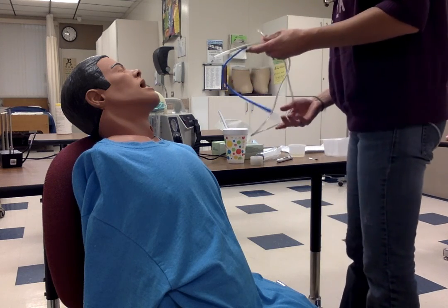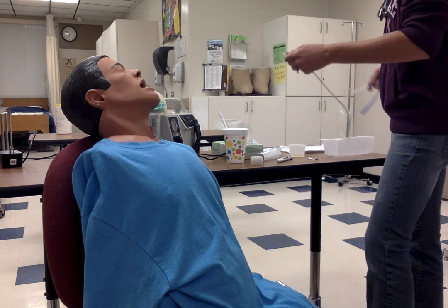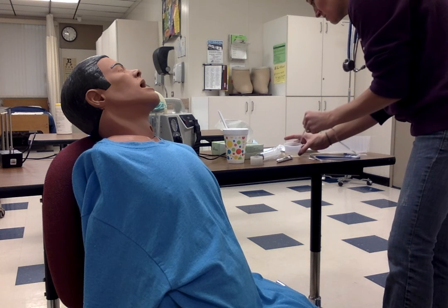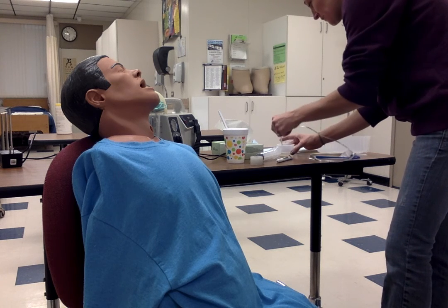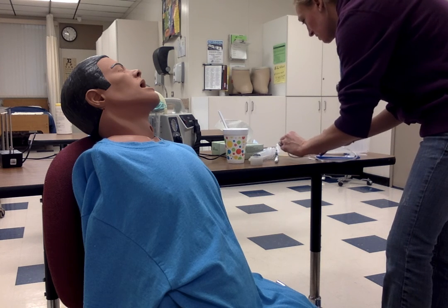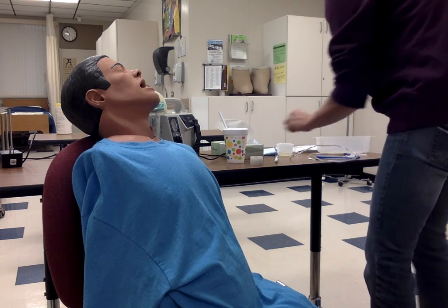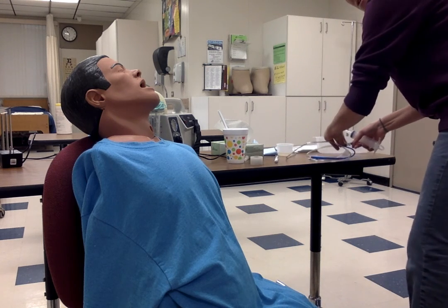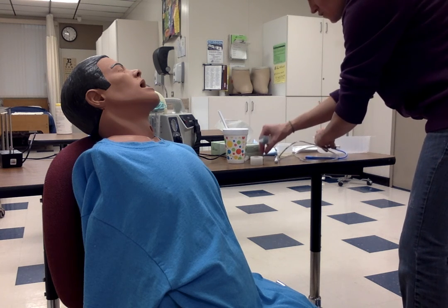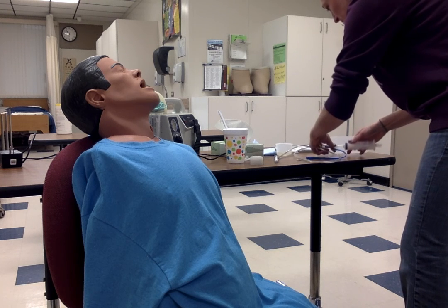So I have this ready to go, and what I have here is some lube that we're going to use. I'm just going to set this in here for now. That's not going to want to stay in there, so we're going to say that's in the container there. I'm going to get my syringe ready to go, and I'm going to take this piece out. This piece is very important. I don't want to lose that. I will be needing that later. So I'm going to put that right on the table there.